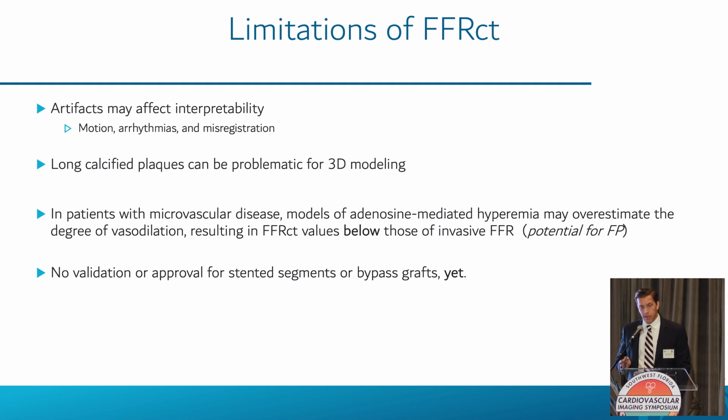All right, so what are some of the limitations of FFR? It's not perfect. Obviously, artifacts affect interpretability. Same applies to CT, right? If you have crappy data, you're gonna have a crappy angiogram, you're probably gonna have a non-diagnostic FFR data set. Long calcified plaques can also be a problem for some of the vendors in their 3D modeling.